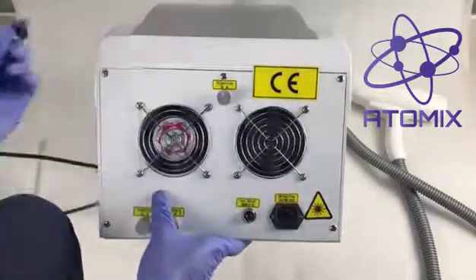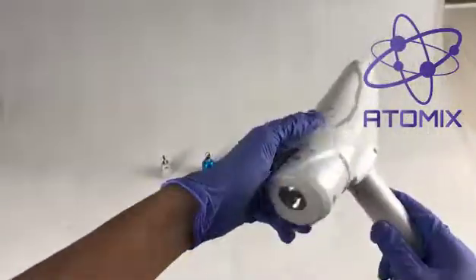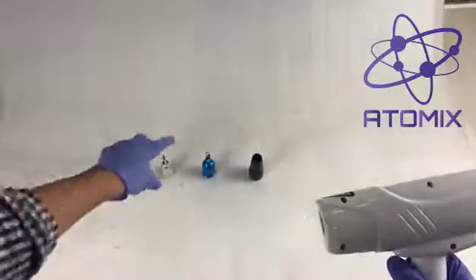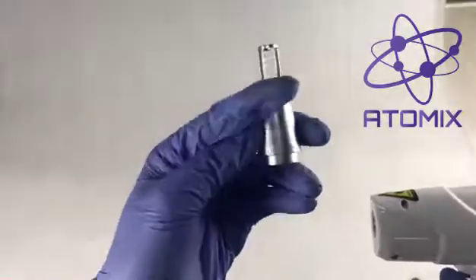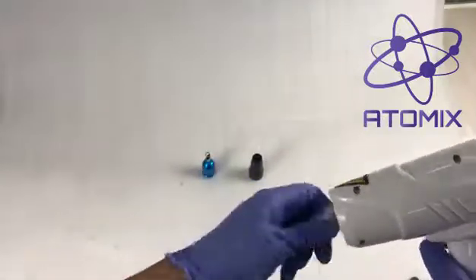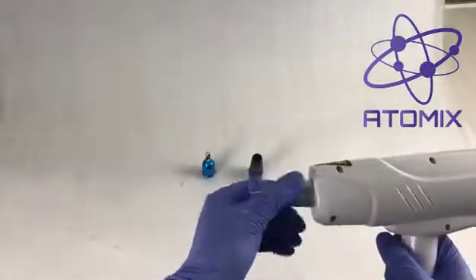One last thing is to install the laser tip. We have three different tips, and essentially this laser head — you just select the wavelength that you want. There's a wavelength imprint on each tip, and you just screw it on to get the wavelength that you actually want or desire.